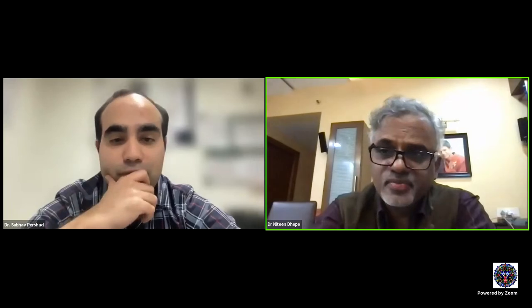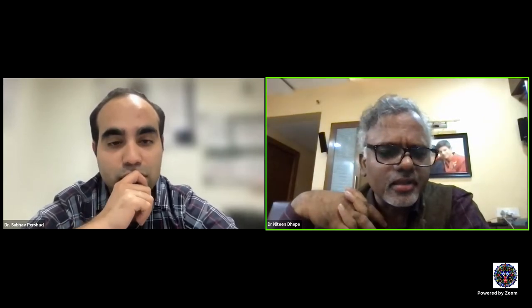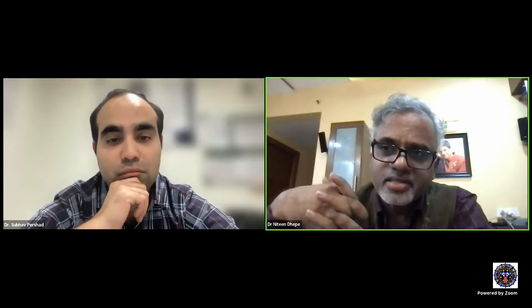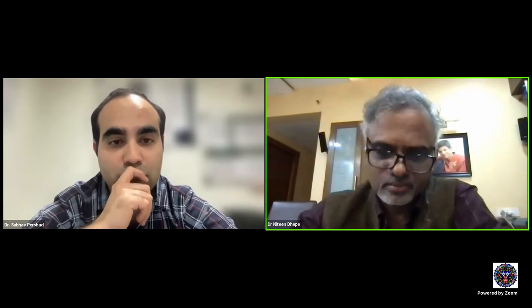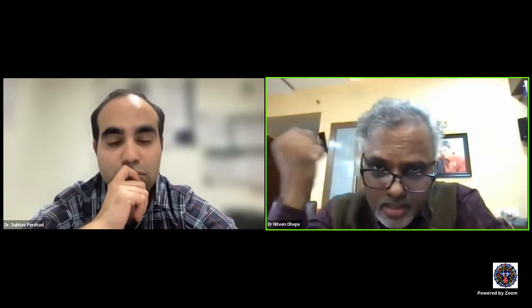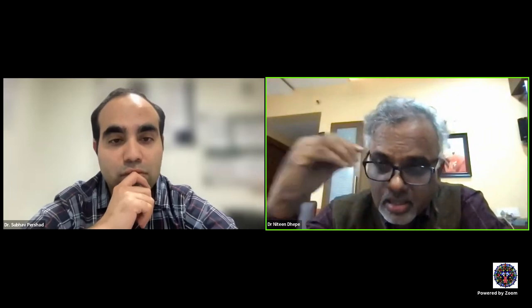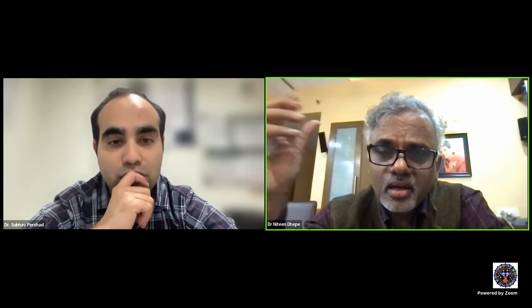Yes, we can. So the first question is, what is the post-procedure care after using lasers in the periocular region? Okay. Again, to be specific, if you are using a hair removal laser, or ablative and non-ablative lasers. Non-ablative means, if you are using the hair removal laser, laser hair reduction, maybe icing, cool that area with ice, because protecting the melanocyte is important. So in any laser treatment, use icing or cooling with cool air. Take the ice in a plastic pouch and start using it. Or you can have ice packs in the fridge and cool that area for the next 5-10 minutes. Then use a topical moisturizing cream.